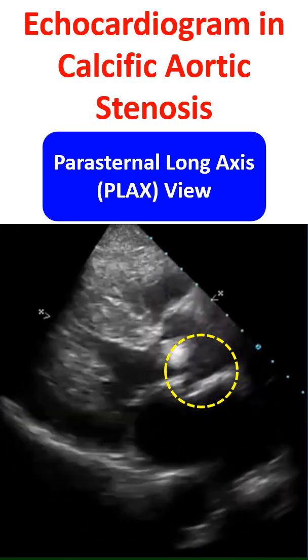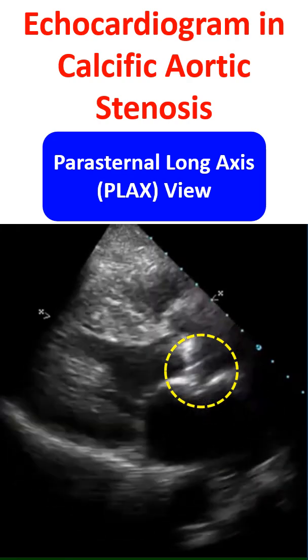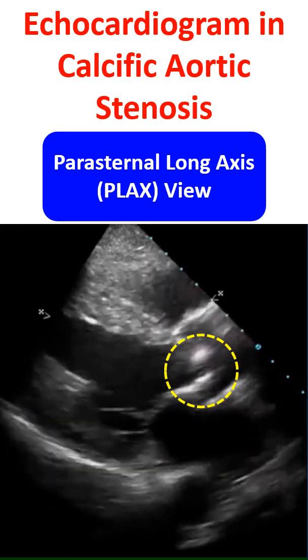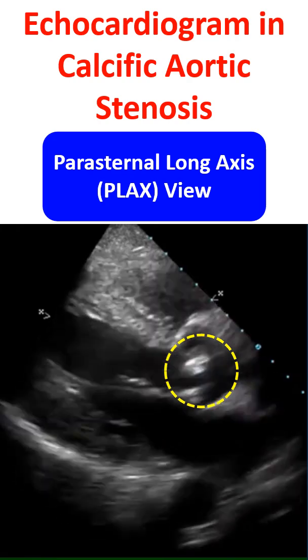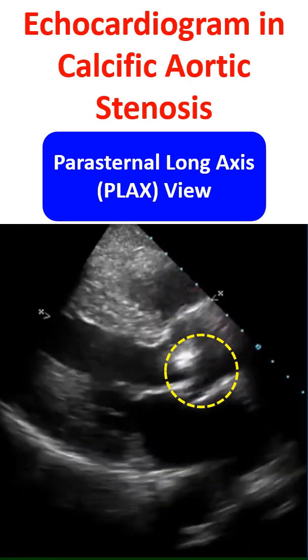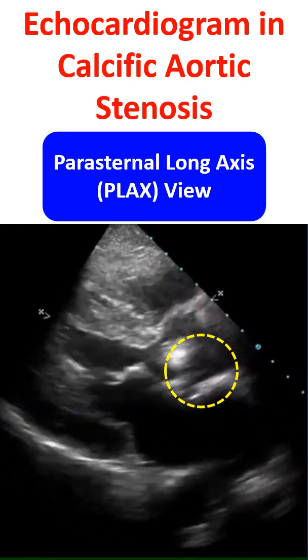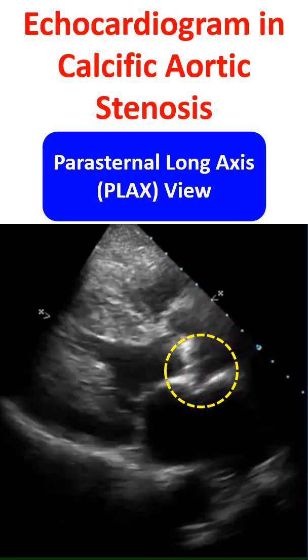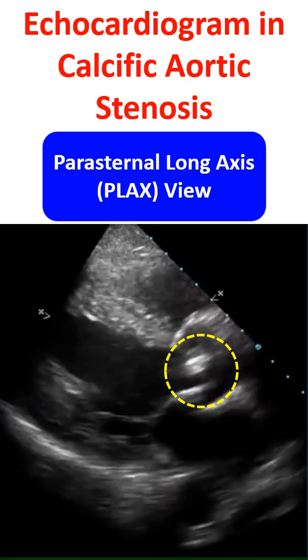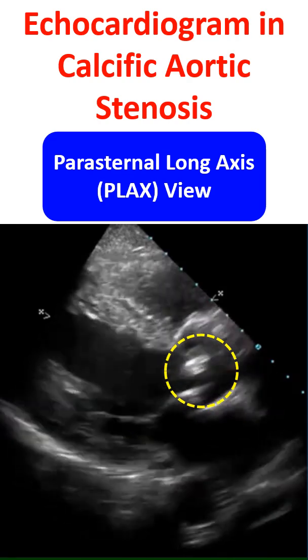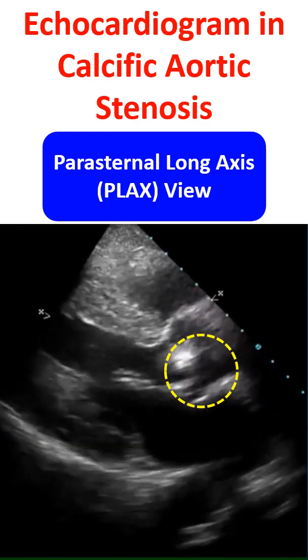Echocardiogram in parasternal long axis view showing calcific aortic valve which domes in systole with restricted opening. The aortic orifice is quite narrow. Normally, valve leaflets will almost be invisible in systole as they will get opposed to the walls of the aortic sinuses of Valsalva.